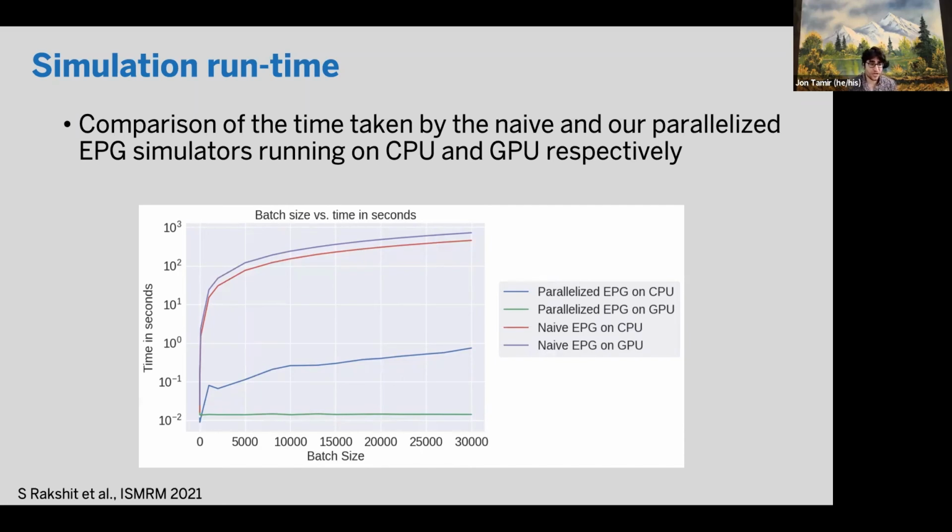And so that's why we're able to take advantage of this parallelization to really push the batch size up until we're essentially memory limited on the GPU. And if we just take this code and we try to do a similar thing, then we don't get this nice scaling with these other simulators. And so this is going to form the backbone of our simulation framework in order to then plug in the learning of the scan parameters with the reconstruction.